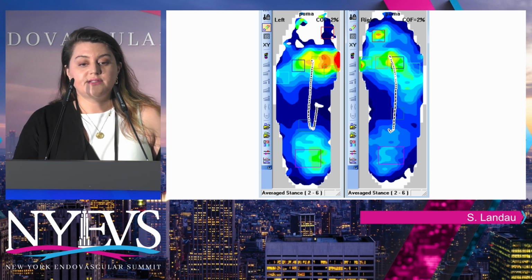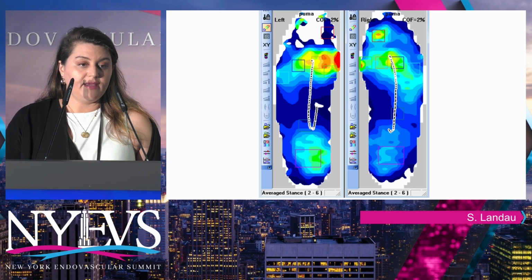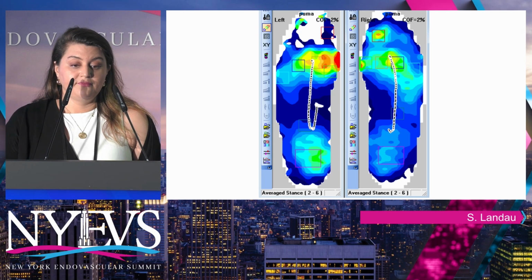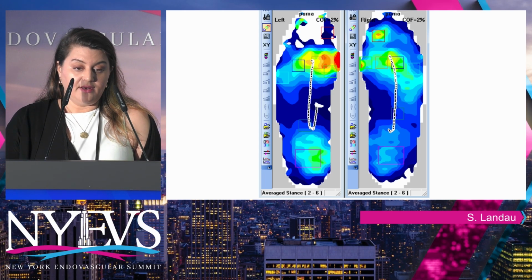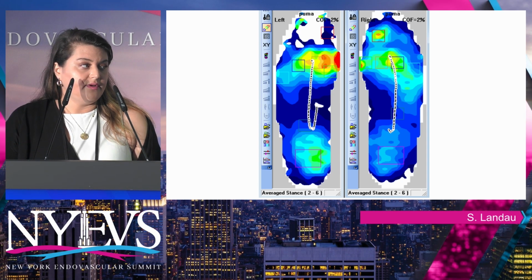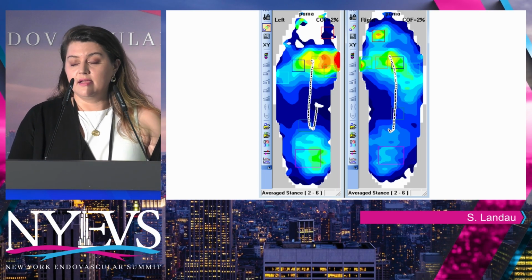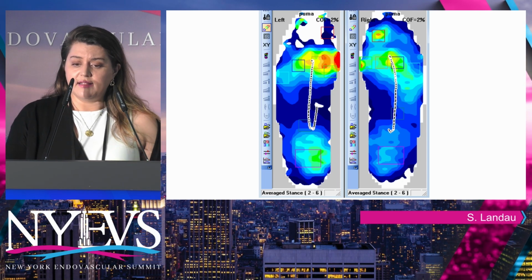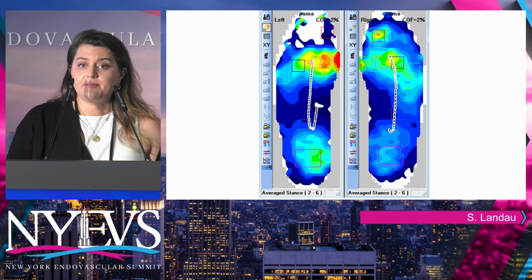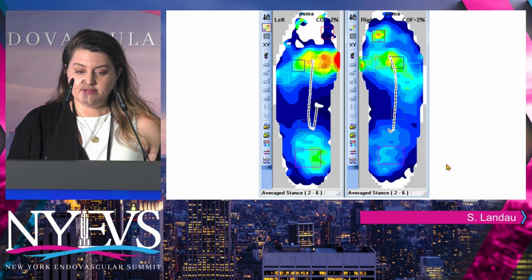According to the studies. So this is just his foot in his Puma sneaker alone. It had a 0 heel drop, which means the difference between the heel and the toe was the same. Ideally for him, that's not what I wanted. And the forefoot had no rocker at all. So what do you think that would do to someone who needs a forefoot rocker? If you place them in a sneaker that has no forefoot rocker and 0-degree inclination, along with a 0-degree heel drop, that actually puts even more demand on the forefoot and increases the risk of pre-ulcerative lesions.